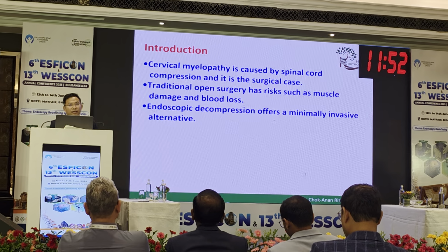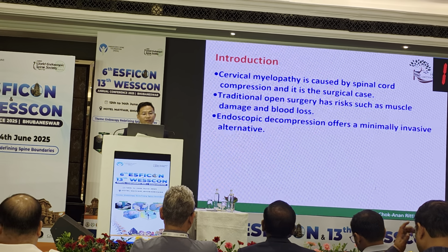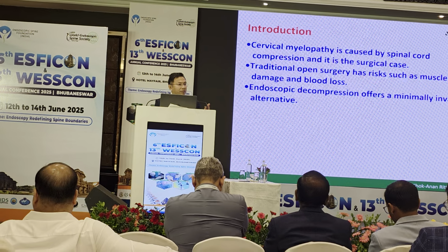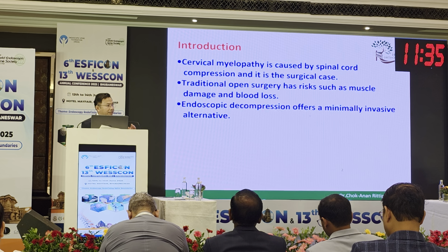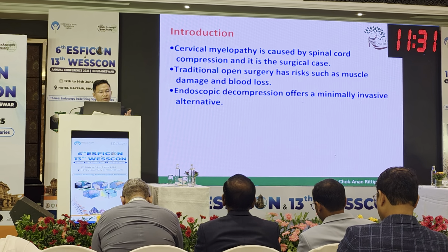Myelopathy is the case of spinal cord compression that everyone knows. But in the past, we used the endoscope for foraminotomy in the cervical spine, right? But right now, many surgeons try to do it with the endoscope in CSM cases.